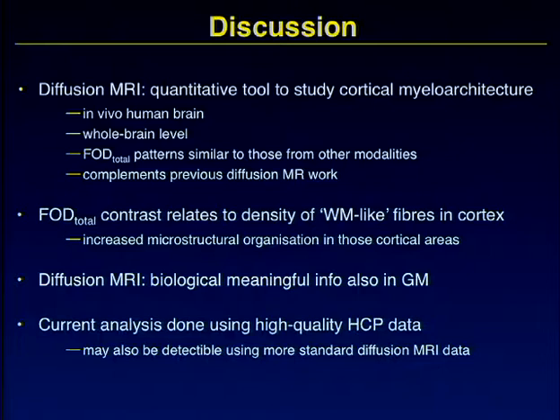If I step back to how we started this project, when I looked at the data published of this fancy analysis, the multi-tissue CSD, I could see these patterns and wondered, just by looking at things, are they real or artifacts? So I tried one data set to see if they're real or artifact, and all these patterns appear. So for the Human Connectome Project, with N = 1, you can see this pattern. Obviously, it's much noisier, as you expect. You will need to do some smoothing and things like that.